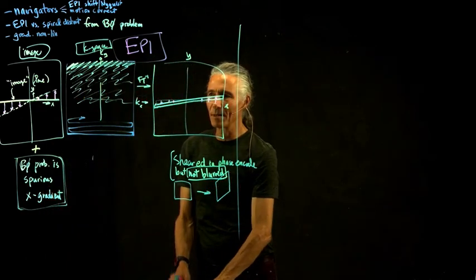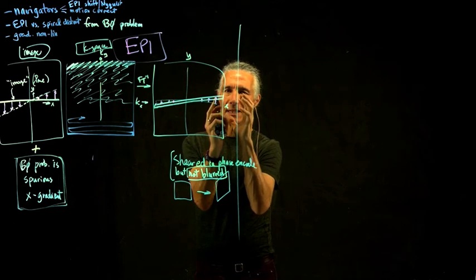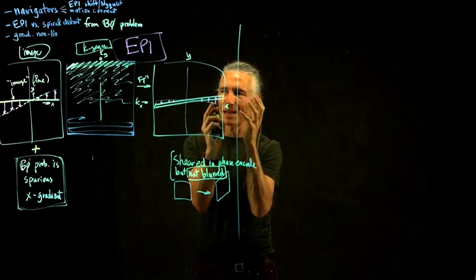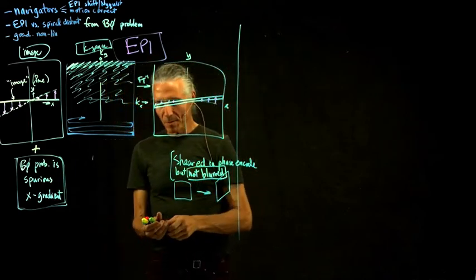It's a little hard to see because you just look at the brain, it looks sharp, but you don't realize it's actually just slightly like that. And the thing is, brains in real life, when you compare them to each other, some people's brains look a little one way, other ones look a little another way, so you can't even see it for the most part, but it's there. But because it looks sharp, people tend to prefer this.